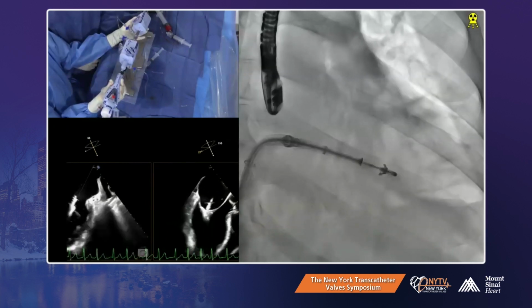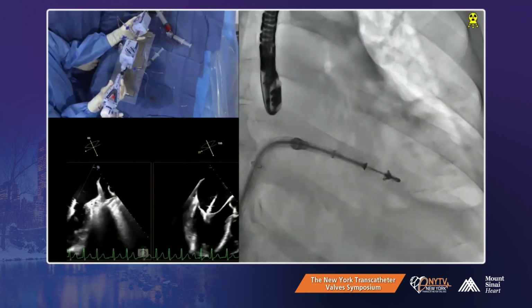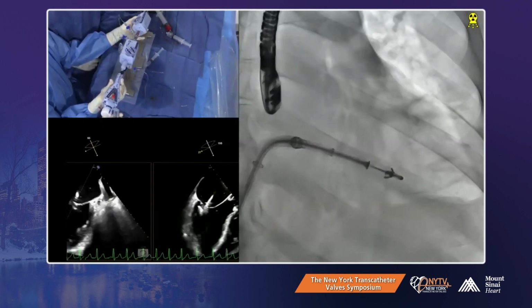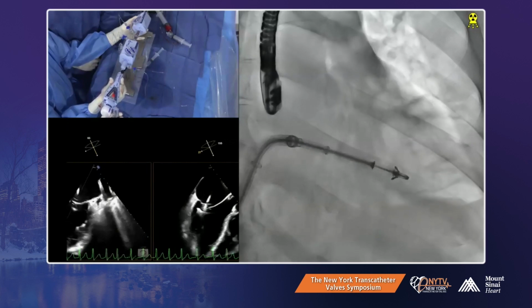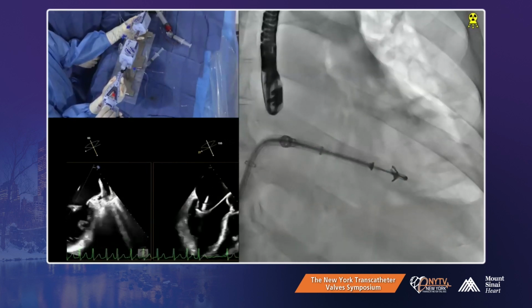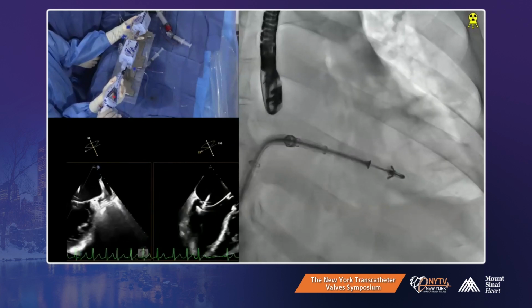Okay, ready? Alright. You have the posterior. It's buckling, right? You saw that. No, no, now it's not. But come posterior. Close the clip a little bit more. Yeah. Close. Try again.